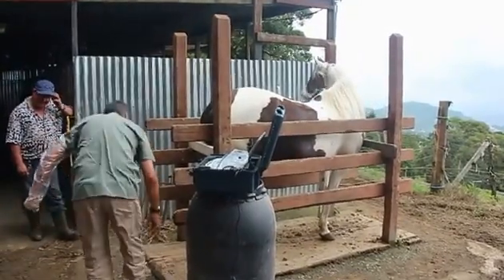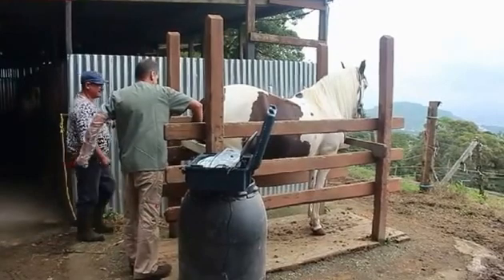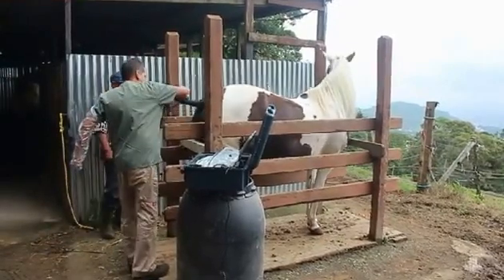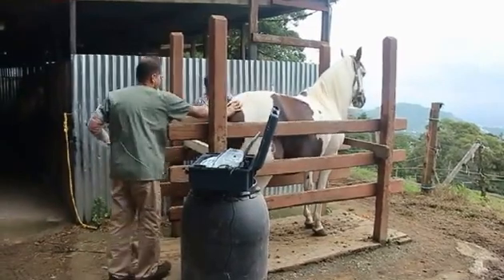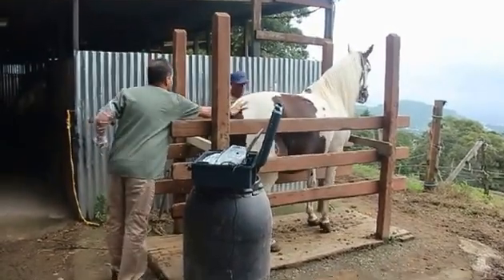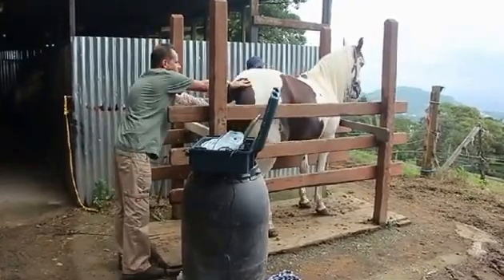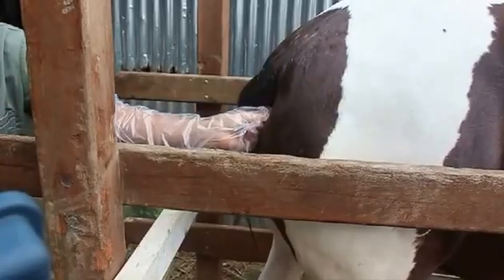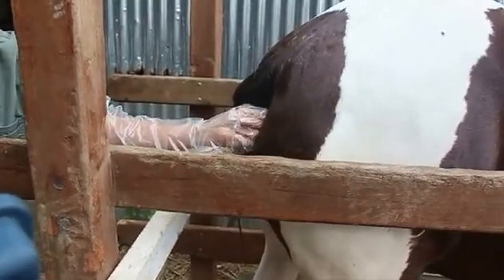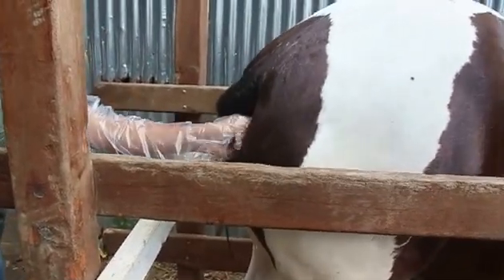This is the not-so-glorified aspect of being a horse veterinarian — there's a reason he has a glove in his hand right now. The horse's stomach is unfortunately too thick for the ultrasound to penetrate, so the only way to do this is to enter from behind. The first thing he's going to do is get rid of some horse poop, and there's only one way of doing that: manually.